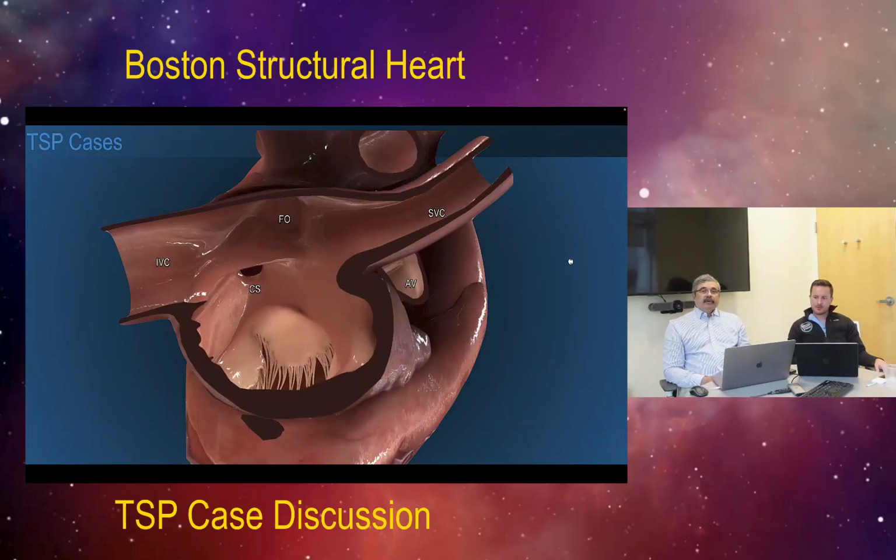So before we go on to do a few cases, we'll briefly go over the anatomy and display of trans-septal echocardiographic display. The most common view is the mid-esophageal bicaval window, where you see the SVC on the right, the IVC on the left, the fossa ovalis in the middle, the coronary sinus below the IVC, and this is actually the true fossa, and this is the aortic valve.